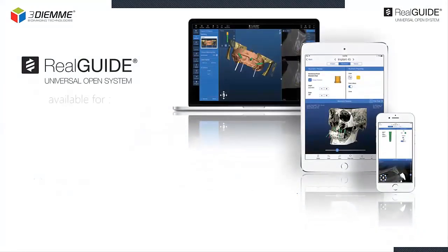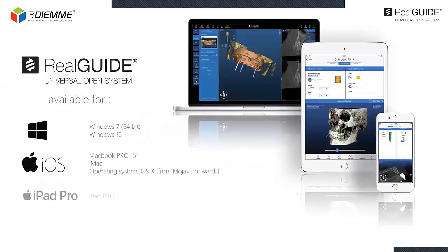Real Guide is available for Windows devices, starting from the Windows 7 operating system onwards, for MacBook Pro and iMac from the Mojave operating system onwards, and also for iOS mobile devices, iPad Pro and iPhone 7 Plus onwards. It's currently not available for Android devices, as unlike iOS devices, they are not yet certified as medical devices for diagnosis.